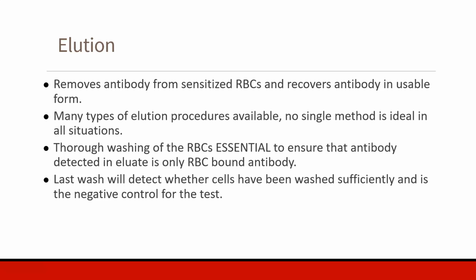So again, the purpose of the last wash will detect whether cells have been washed sufficiently and is the negative control for the test. Sometimes I would test my last wash first, because if it is positive, then your cells need to be washed more. Because once you add whatever it is to elute the antibody, you're done with those cells. You'll have to start over with a fresh 20 drops of cells.